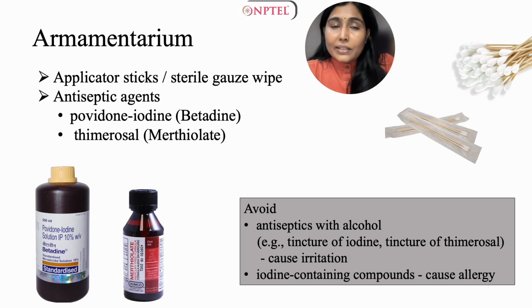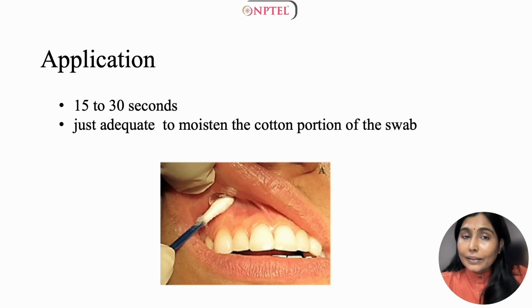Before any iodine-containing topical antiseptic is applied to the tissues, the patient must be questioned to determine whether adverse reactions to iodine have previously developed. The application of any antiseptic is for a duration of 15 to 30 seconds. There is no need to place a large quantity on the applicator stick. It should be sufficient just to moisten the cotton portion of the swab.